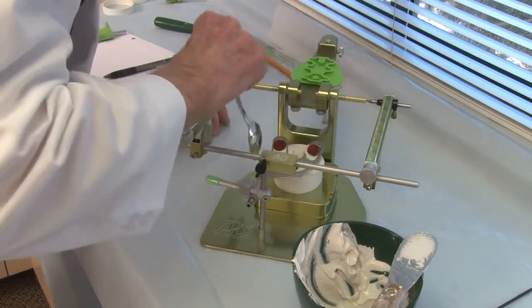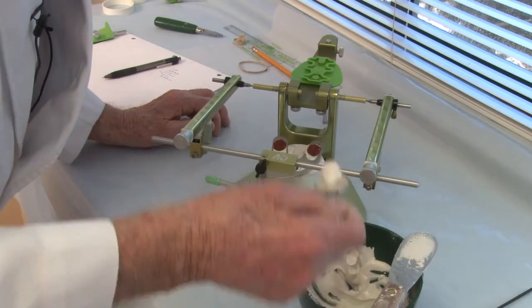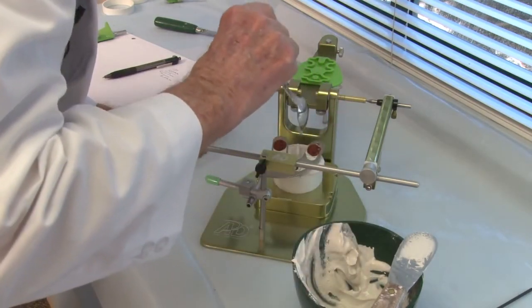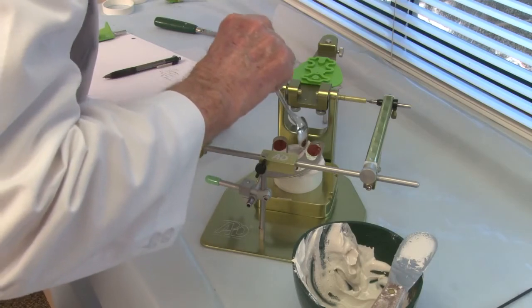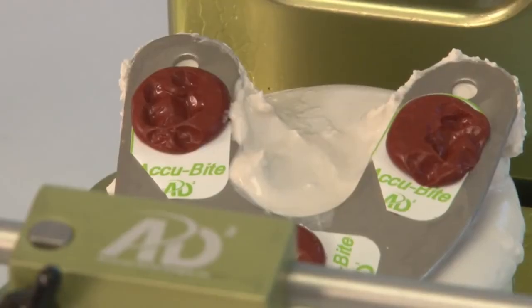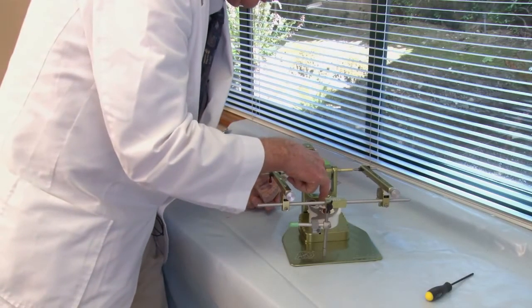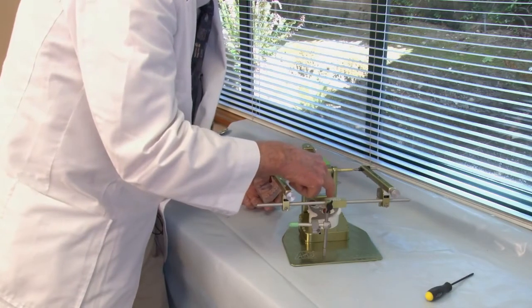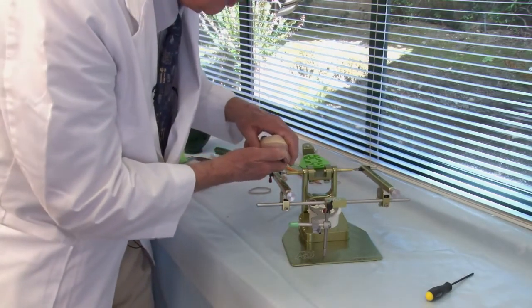Just making sure now I get the stone underneath the bite fork, supporting the bite fork good. If you want to bring a little bit up on the bite fork, it's okay, except make sure you don't get it where the teeth are. Mounting stone is hard now, so we know our bite fork is supported, and I can go ahead and put my model onto the bite fork.